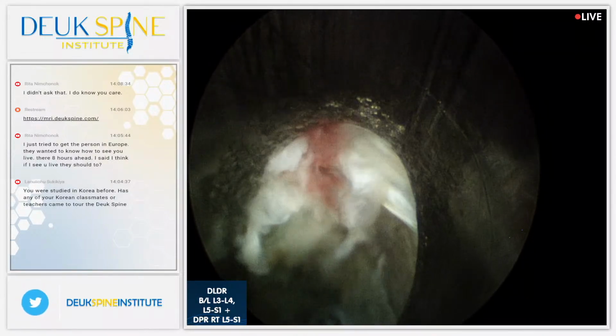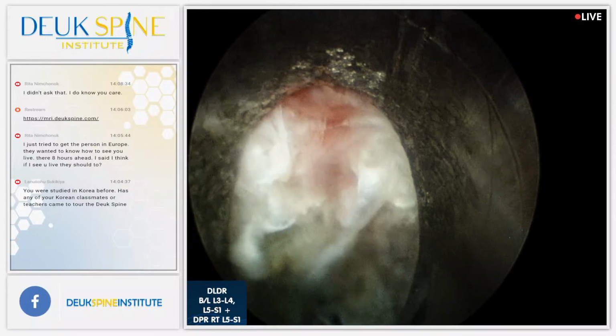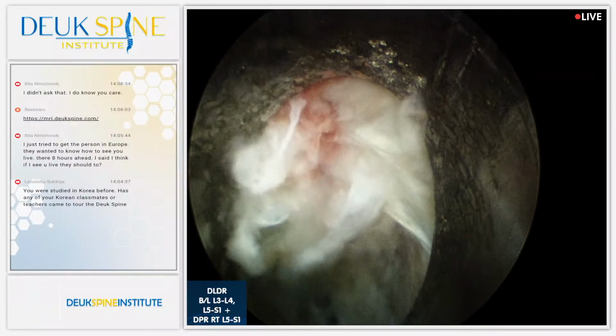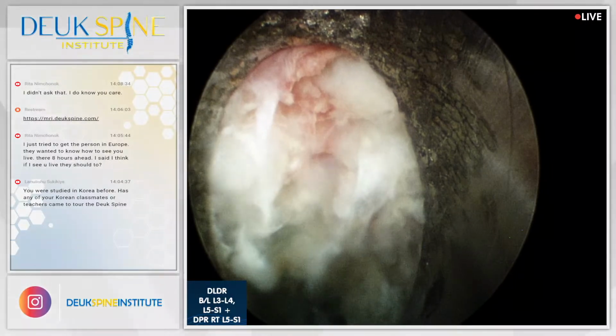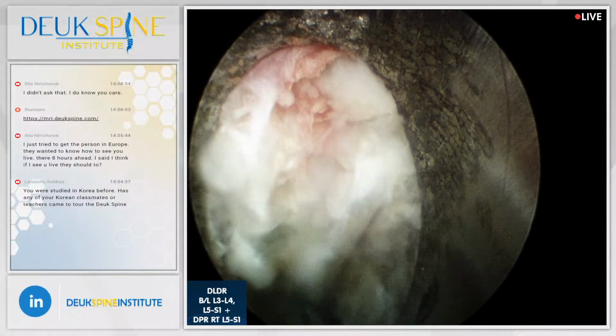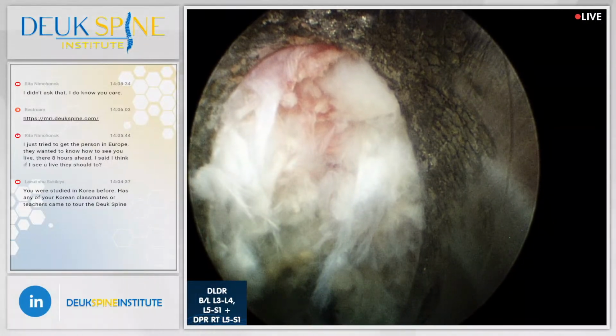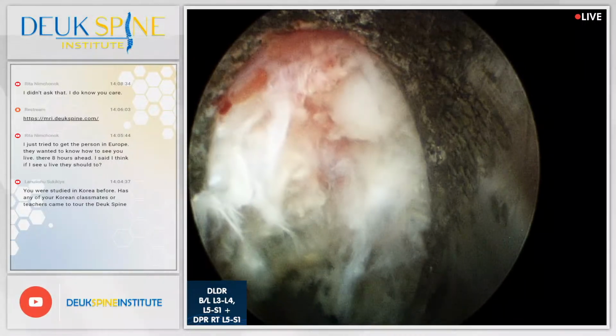And oh, look at that, folks. Inflammation. Beautiful inflammation. That's why we're here. That's perfect, Henry. I can take a photo. Yeah, you want to get a quick screenshot? Look at that. That's absolutely gorgeous. Right in the crack.